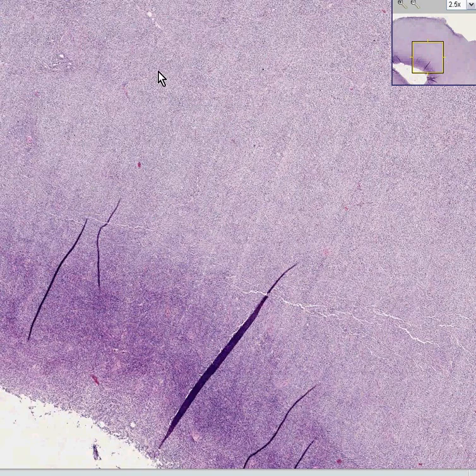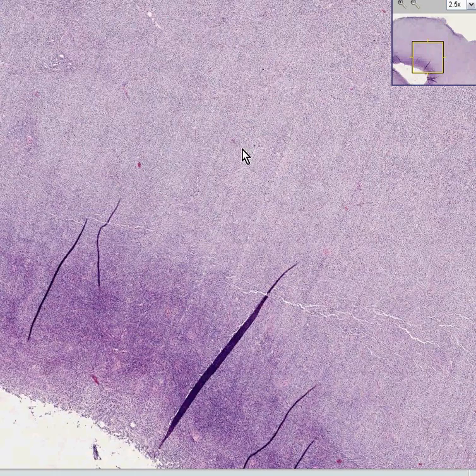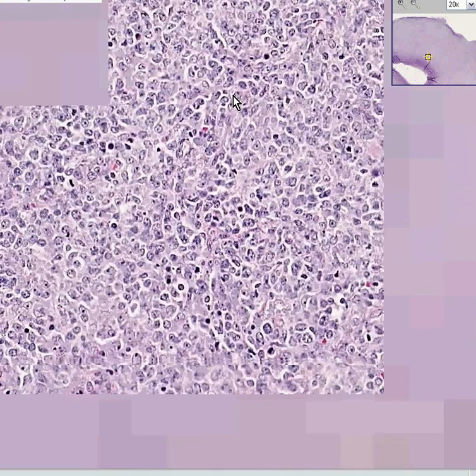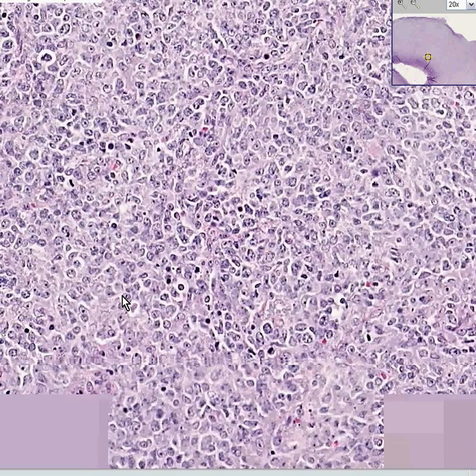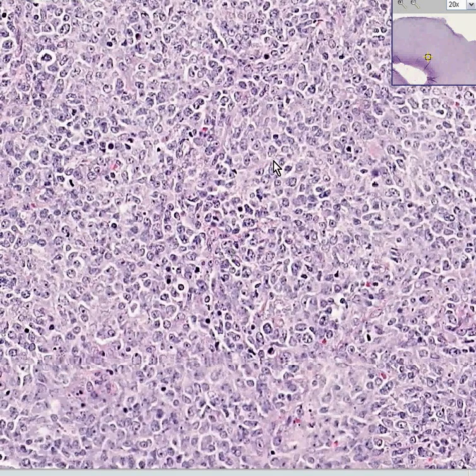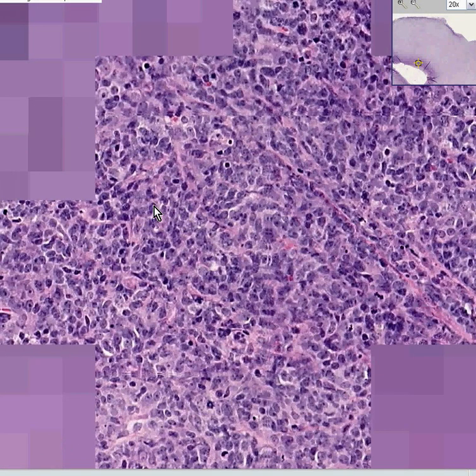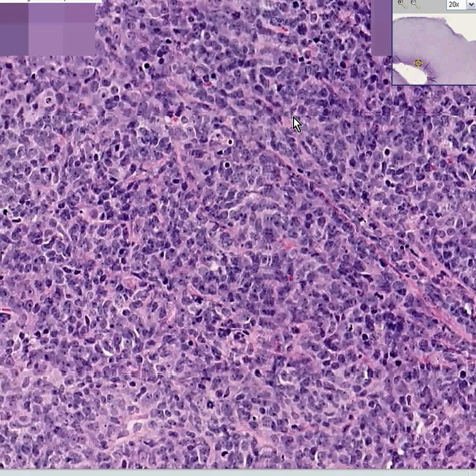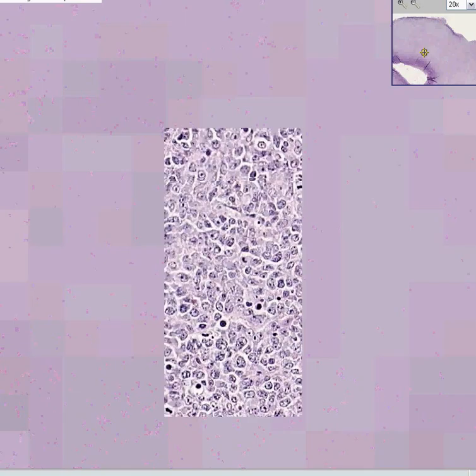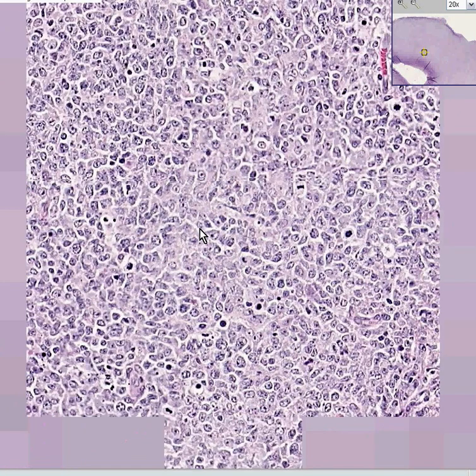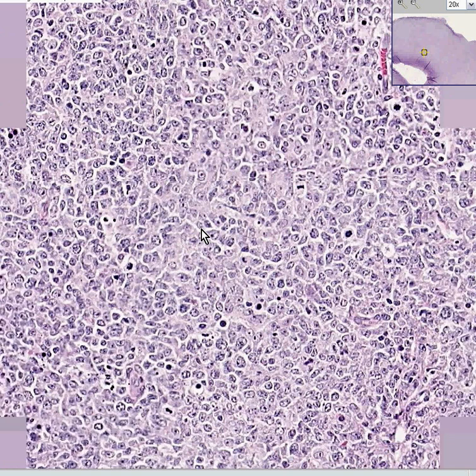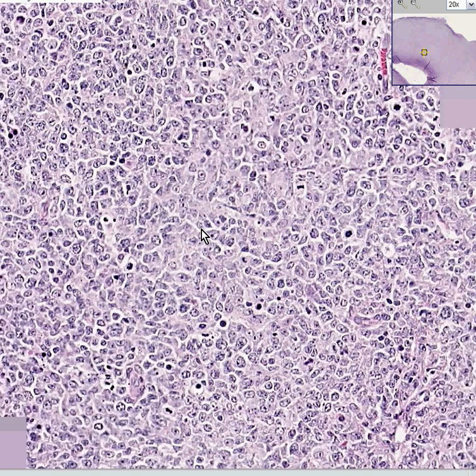We can also suspect that the majority of cells here, because it looked like they have so much cytoplasm, that they would generally be much larger cells here than what we would normally see in the more smaller cells. So this is predominantly a diffuse large cell lymphoma.